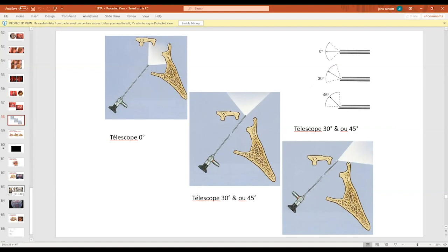But when you do craniopharyngioma, you need to drill a little bit the tuberculum sellae. So you need to have an angled endoscope to be able to see the optic chiasm and see above. Yeah, so these are the nuances that you have. But for me, sometimes I'm comfortable using a 30-degree endoscope because it allows me, when I get into the nose, to look downward, to see the floor. And then from there, I'm pretty sure that I will not go too high. Okay, next.